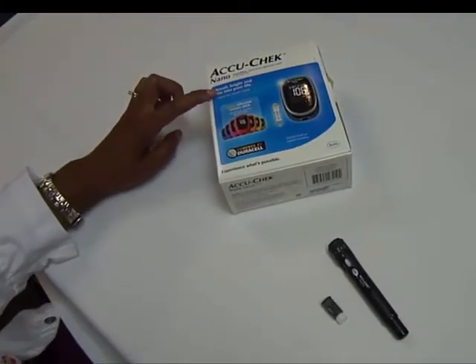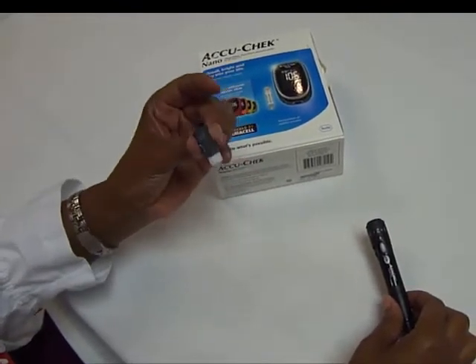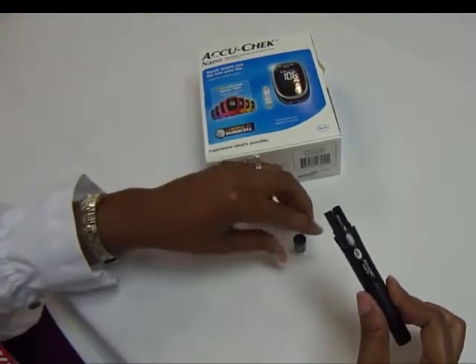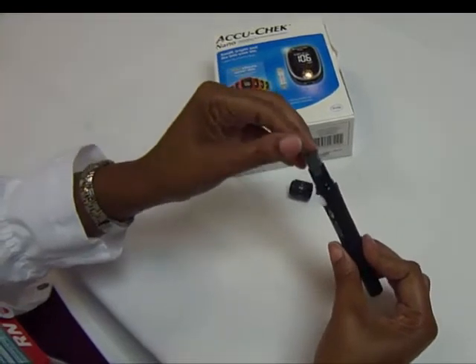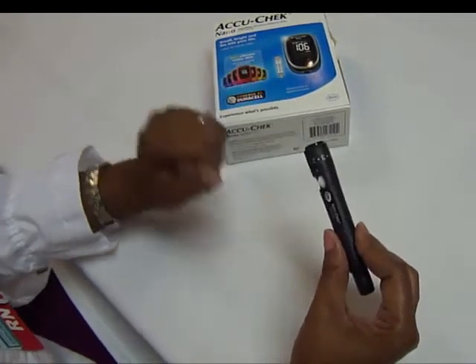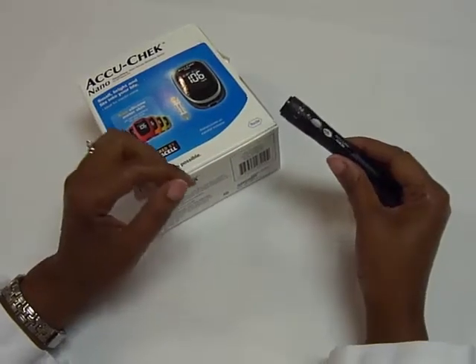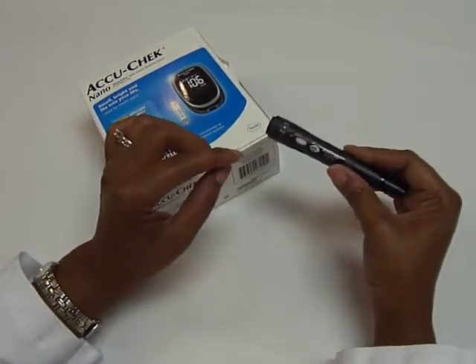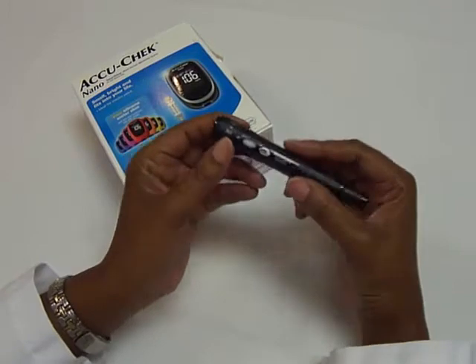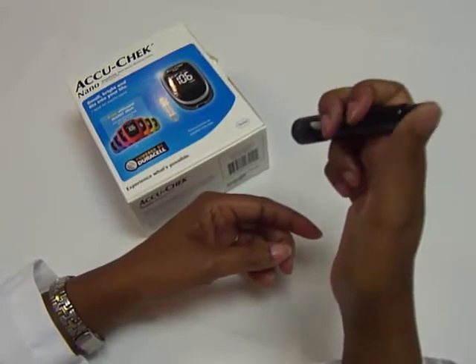This is the AccuChek Nano. This is the lancet device, and this is the lancet drum. I'm going to load the lancet device. I'll just take the top off, drop the drum inside until it's flush, then I'll put the cap back on, and it's loaded. I'm ready to do my finger stick. I'm going to make sure this circle is firm against my finger. I place it firm against my finger, and I push the end to do the finger stick.